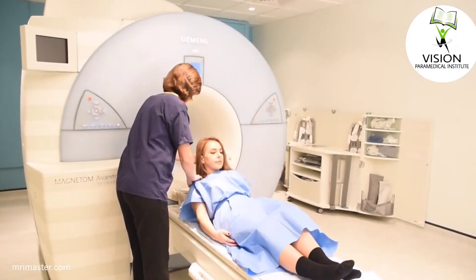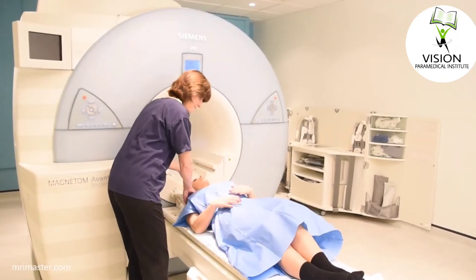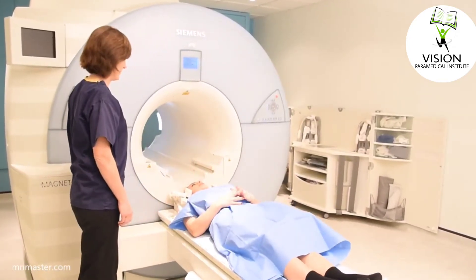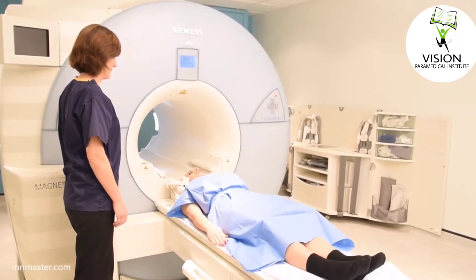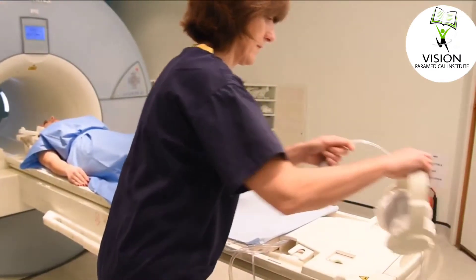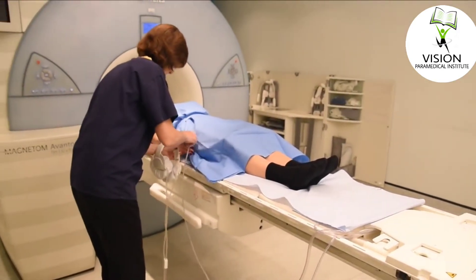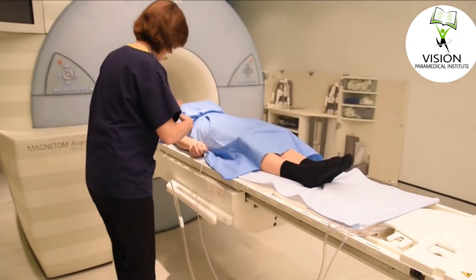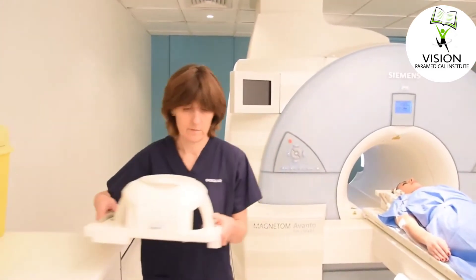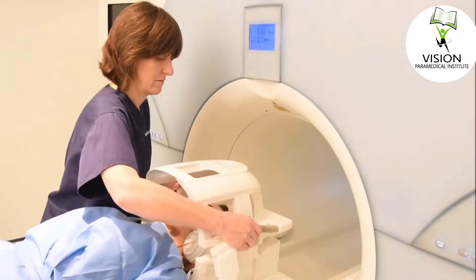After carrying out your safety checks, bring the patient into the scanner room. Help them to lie supine on the bed with their head in the head coil. Provide the patient with an emergency buzzer and make sure they know how to use it. Provide headphones to protect the patient's ears, and put the head coil in place.